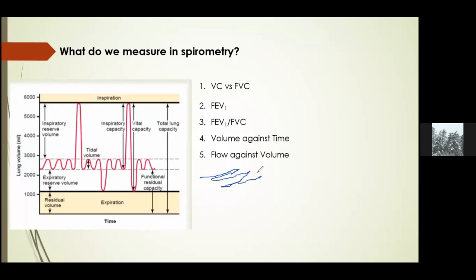It's like a tide. It comes in and then it ebbs to and fro. That is where the name tidal comes from. It just slowly goes in and out. And during this period of time, you do not force air. It is quiet breathing. So during quiet breathing, the volumes you measure are tidal volumes.